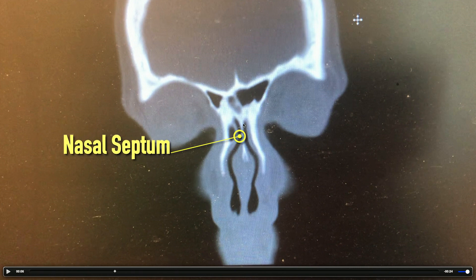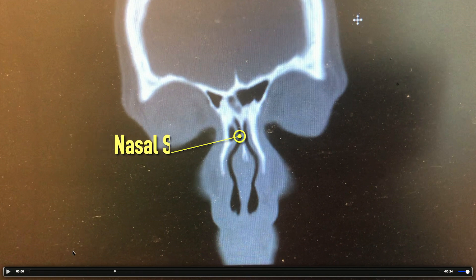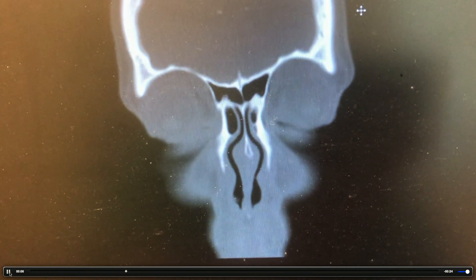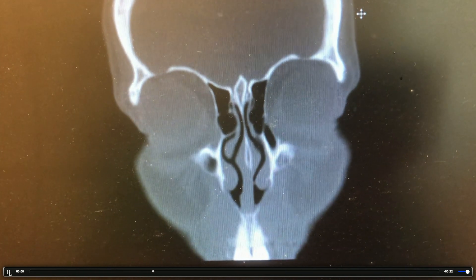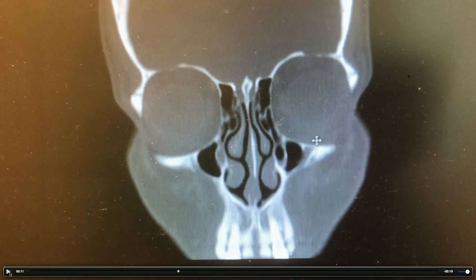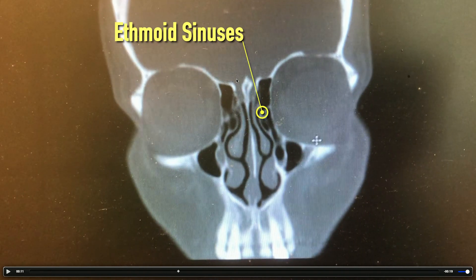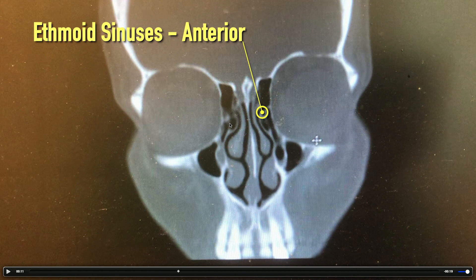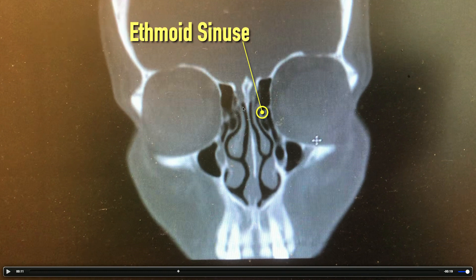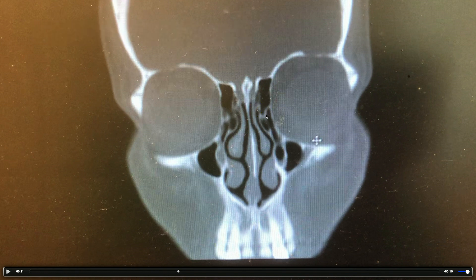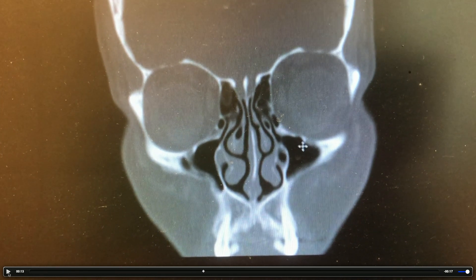We're starting to see the nasal septum right here. You can tell that the nasal septum is a little deviated to the left side — that's the patient's left. Going a little bit further back, the next sinuses we're going to start seeing are the ethmoid sinuses. The ethmoid sinuses are between the eyes. This is completely normal. We see black, and we see little bony fragmentations here — we call them little lamella of bone.